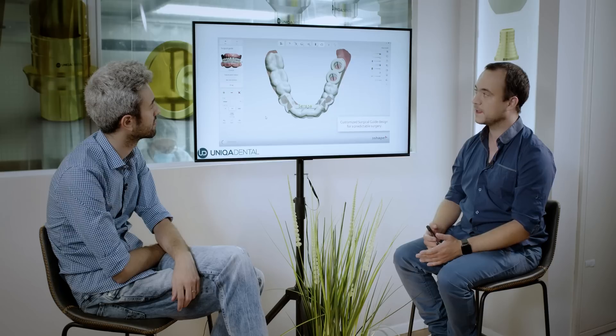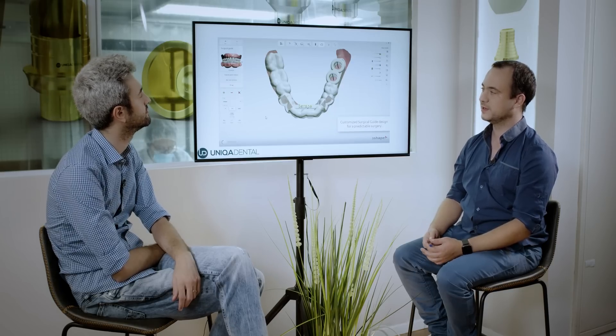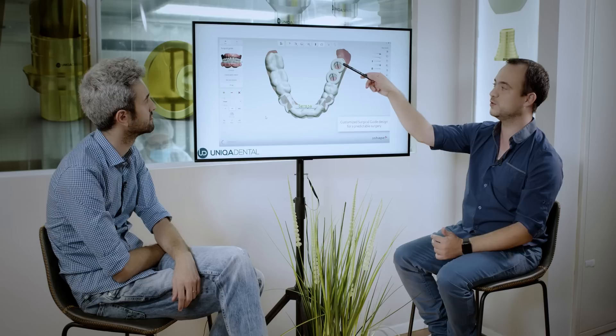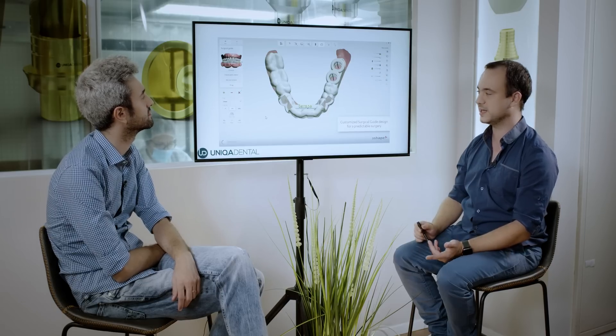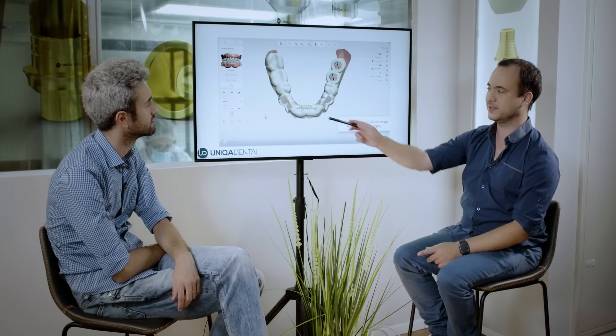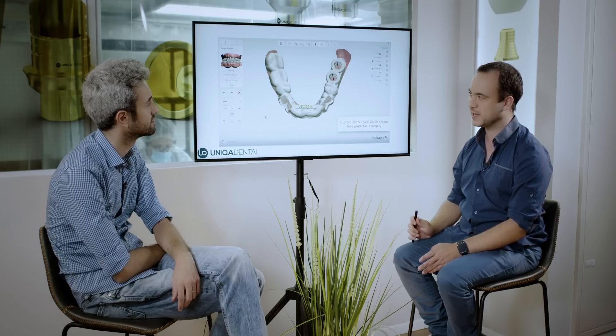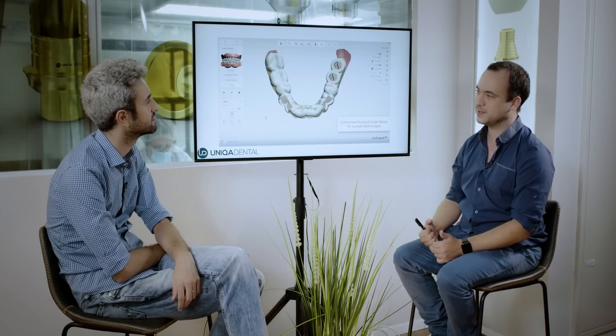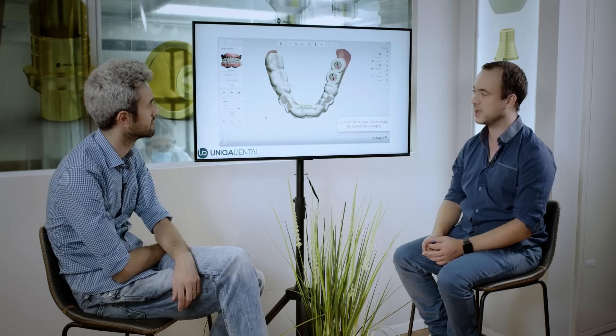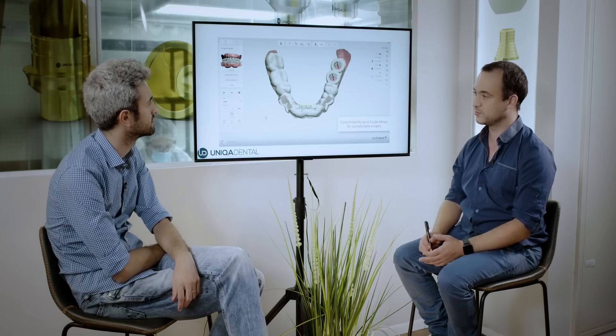This way we can ensure that the implants will be right under the crown and everything will go smoothly. In here you can see the program exported our guide. You can see two places for two implants, as we designed those two crowns. You can write the name of the patient on the guide. It goes onto his teeth and then you just drill through the surgical guide and place the implants also through the surgical guide.